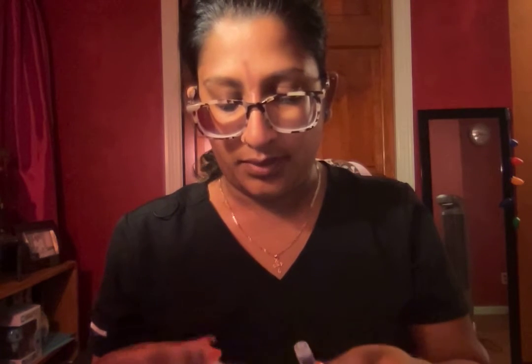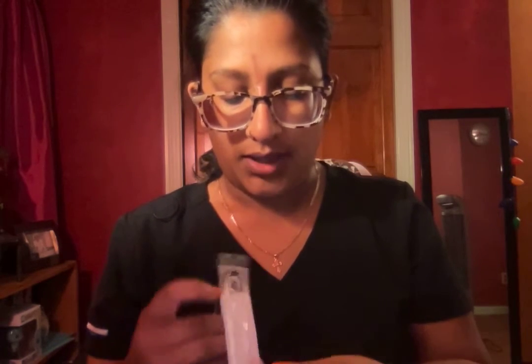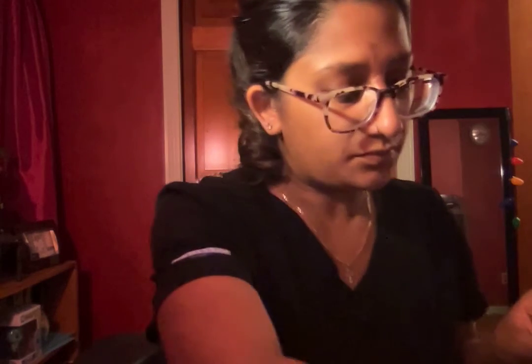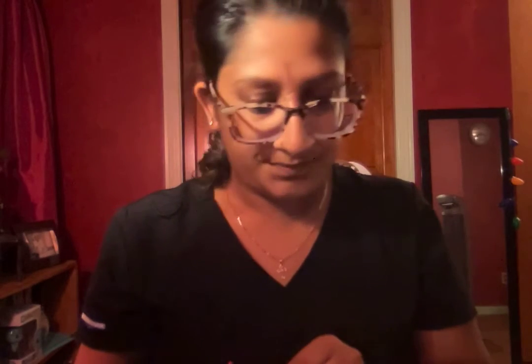I am going to open up the syringe, make sure I don't touch the top of it. And I'm going to open up the needle and make sure I'm opening it up in a way that I'm not touching the top of it. I'm going to screw it in. Okay. I'm going to draw up some air, 0.4 air in the syringe.